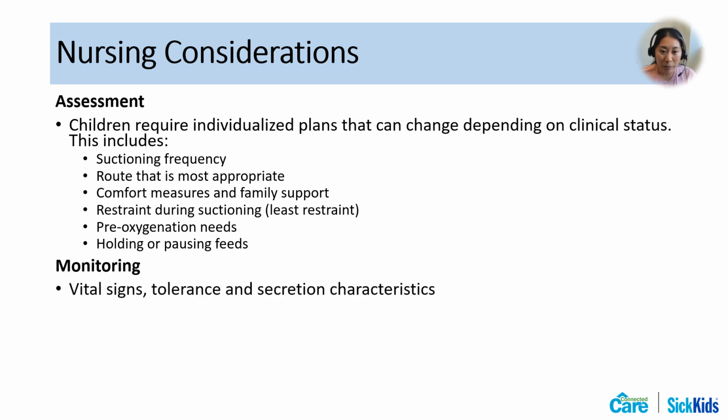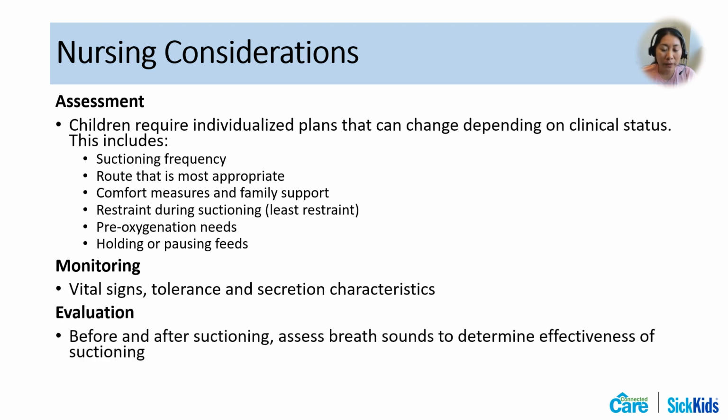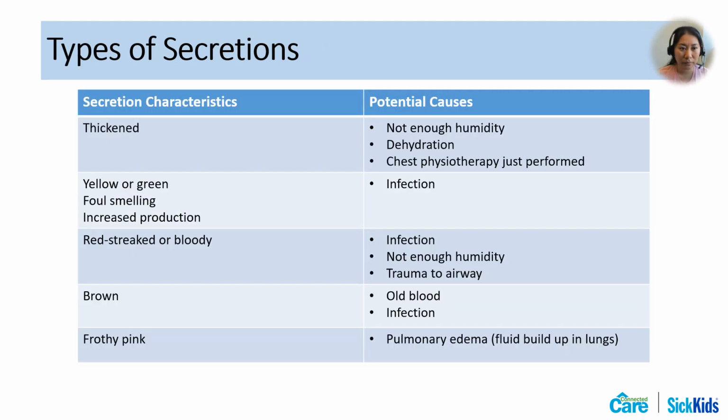All patients should be monitored for changes in their vital signs, for their tolerance of suctioning, and for any changes in the characteristics of their secretions. Finally, the effectiveness of suctioning should be evaluated by assessing their breath sounds before and after.